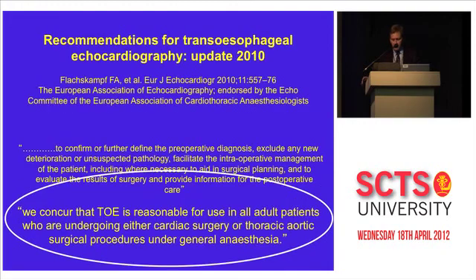Not only they, but also the European team with Dr. Flachskampf and Dr. Fenech said that we concur that TOE is reasonable for use in all adult patients who are undergoing either cardiac surgery or thoracic aortic surgery under general anesthesia. So I suspect in the future, as equipment becomes more readily available and people train and understand it better, we're going to see it in all operations.